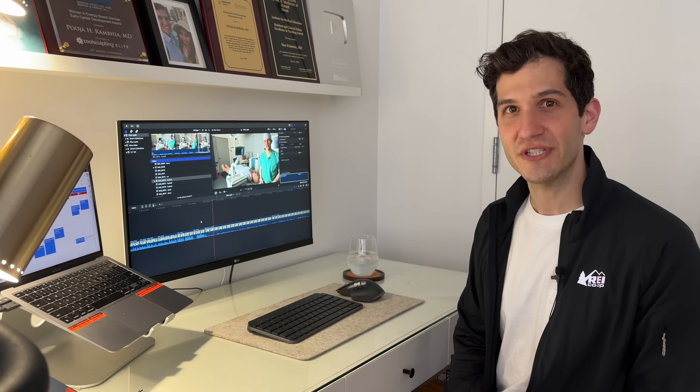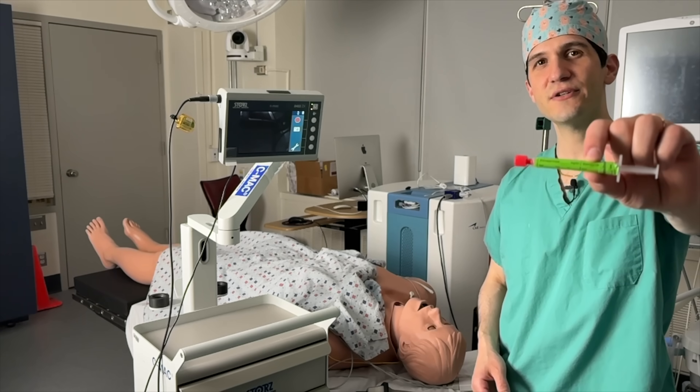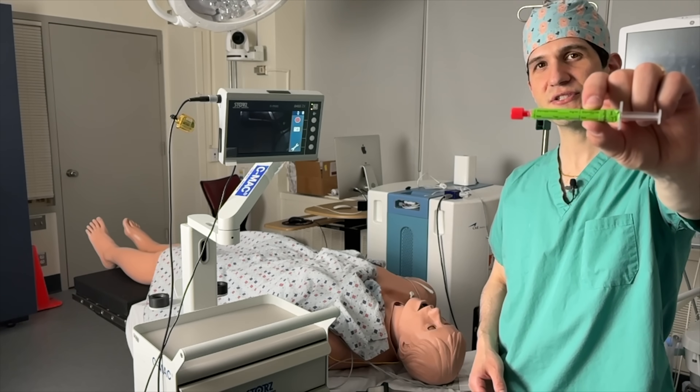It appears my cameraman walked off the job and left the camera on slow motion while it was recording, and the sound doesn't recover when run back at full speed. All that I was trying to say here was that it could be helpful to administer a medication called glycopyrrolate to patients, which can cause their mouth to dry out, making it easier to use the fiber optic scope so that you don't get any secretions on the camera.